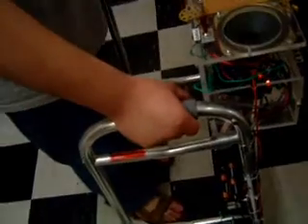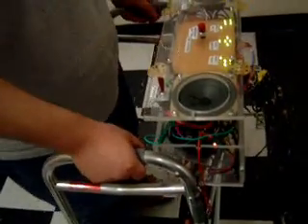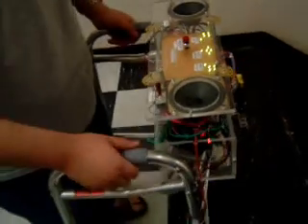Now, notice when I put my hand over the photoresistor, the brakes are released and I can freely move forward. When I release, the brakes will lock again.